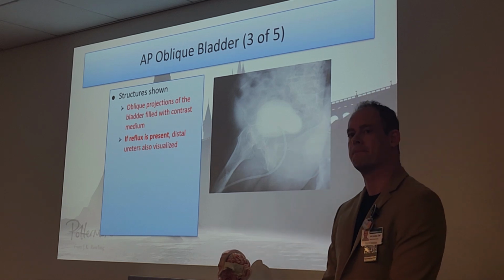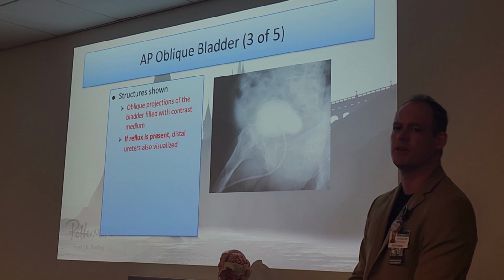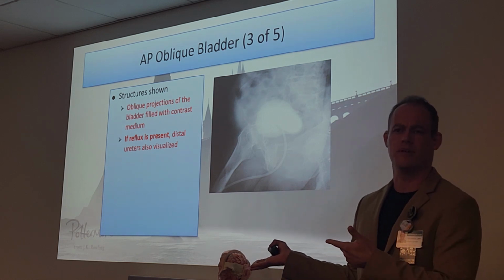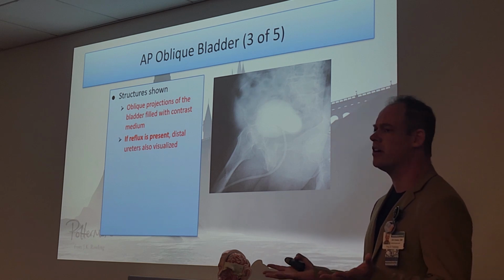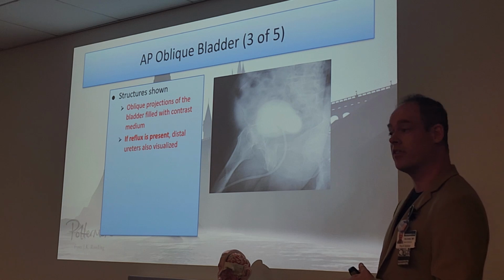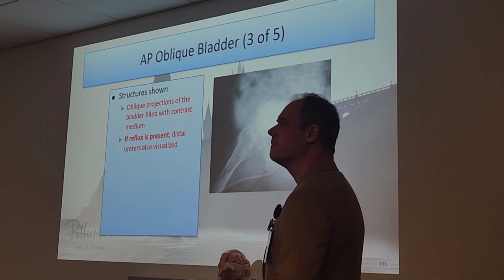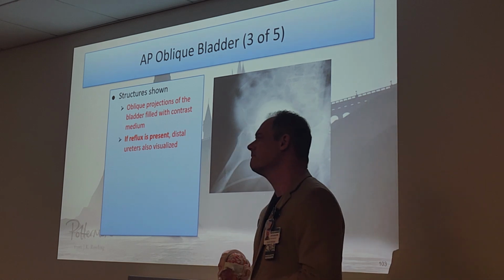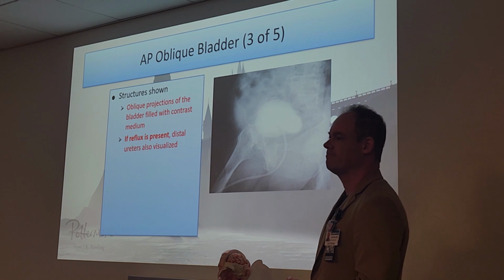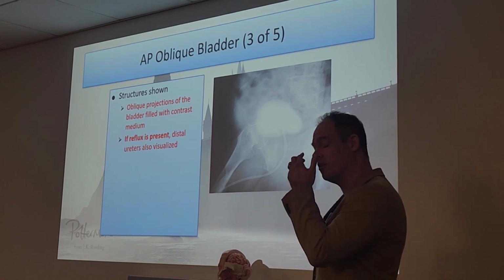Will they do both? It depends on what the doctor wants. Typically just one, but he may ask for both. And usually these are all done under fluoro. You're not doing the plain films like we're learning about here. These plain films are very rarely done anymore in fluoro. They did plain film yesterday, on the lady and on the man. So it's per physician request, basically, on plain films or fluoro.